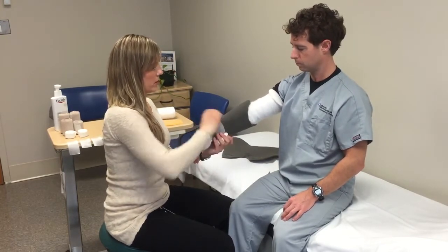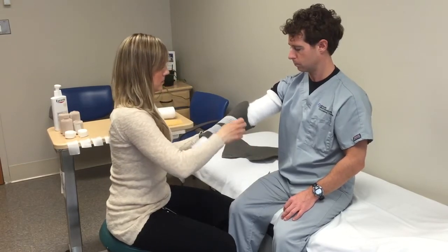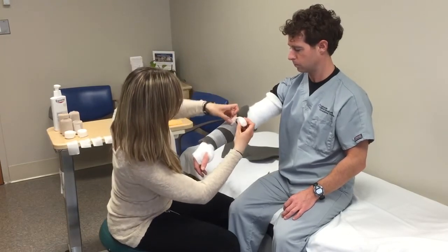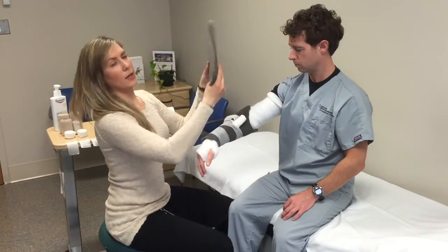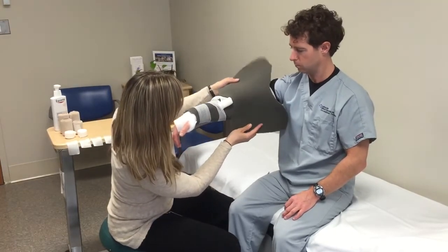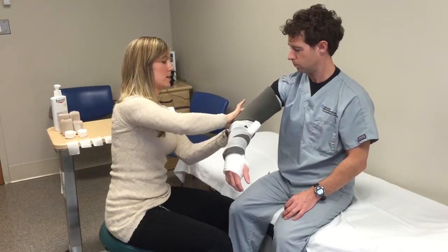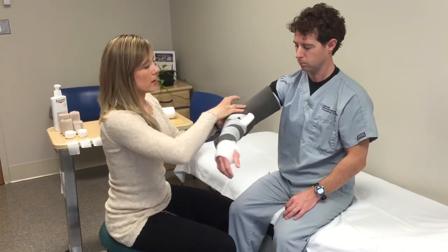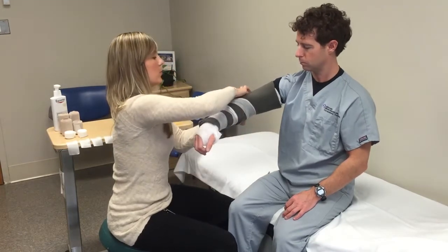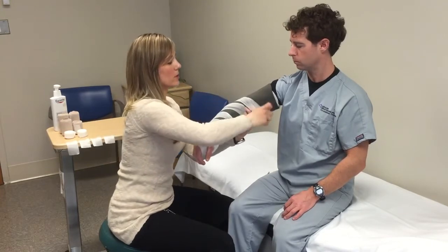Ideally you'd have some overlap that you would fold over. Take your stretchy gauze just to hold it in place — you can tuck your gauze in — and then apply your top piece. Line everything up, try to tuck everything in nicely, and then continue securing everything with the gauze. The point of the foam is to make the bandage more comfortable and more dynamic.